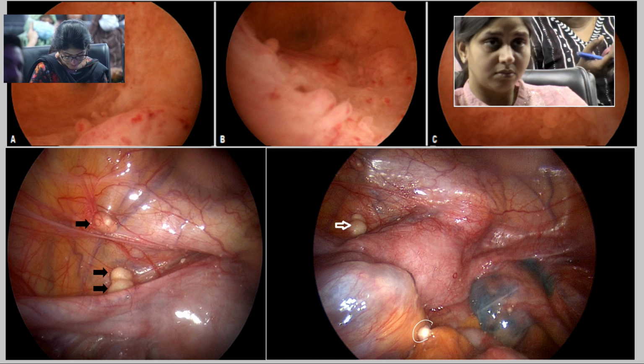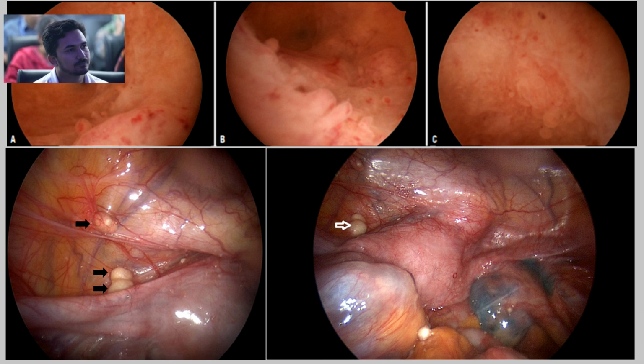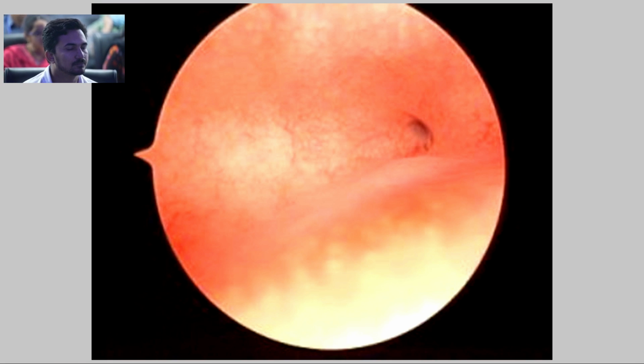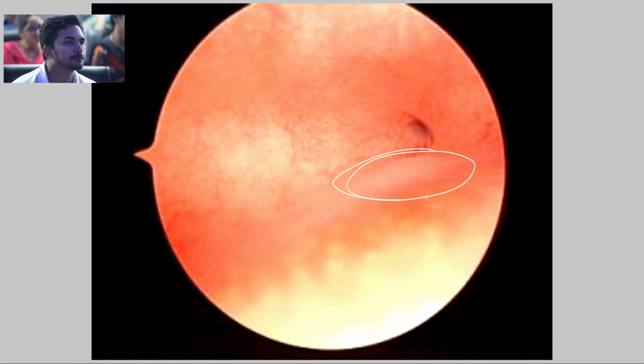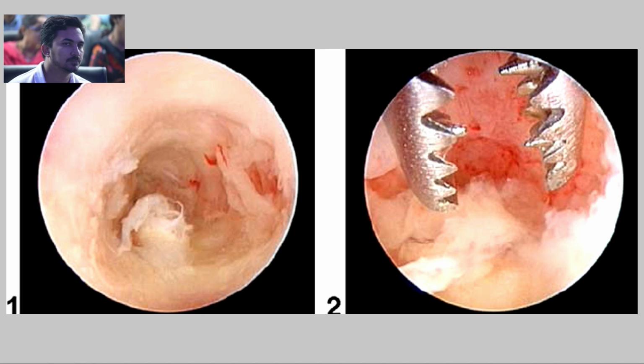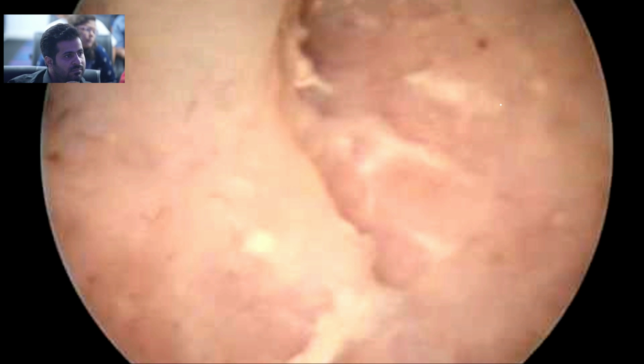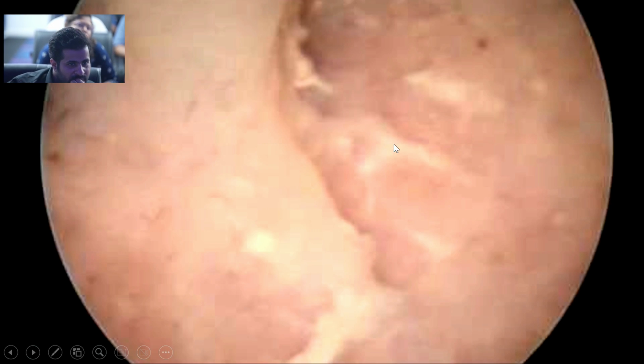This is early endometrium, you should try to take care of. Tuberculosis. This is also tuberculosis, early tuberculosis. This is very bad, late tuberculosis. You can see entire cheesy appearance. This is very bad cases of infertility. This is also the same, a little close up. This is the same picture, here it is close up.